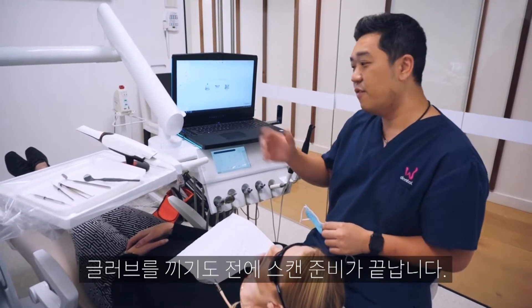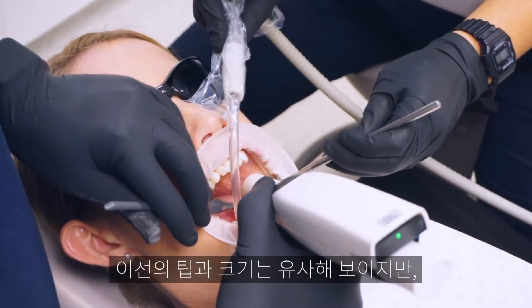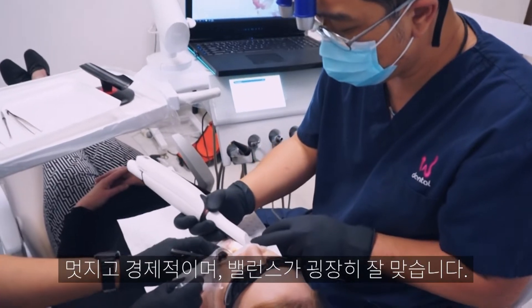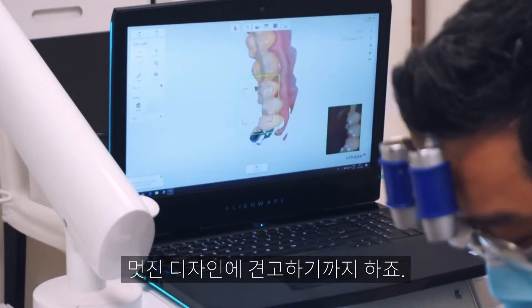I haven't even put my gloves on and it's ready for a mega scan, which is one of the beauties of these things. It seems to be a similar size to the previous one — nice and ergonomic, pretty well balanced. I really like the new tip; it's nice and firm.